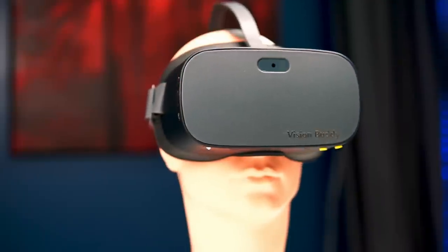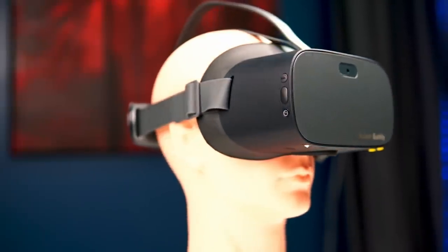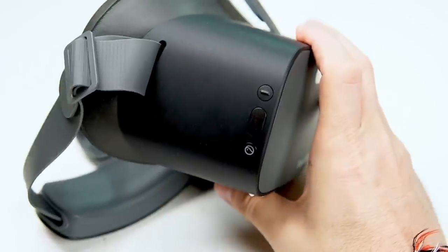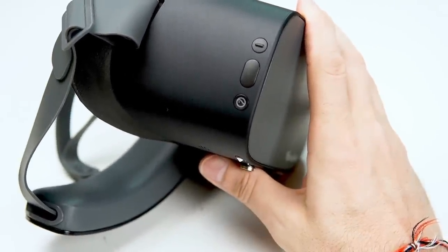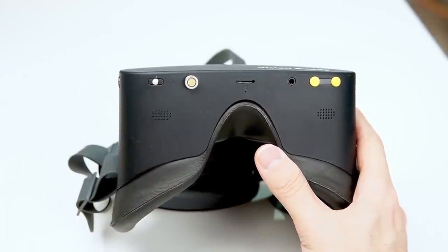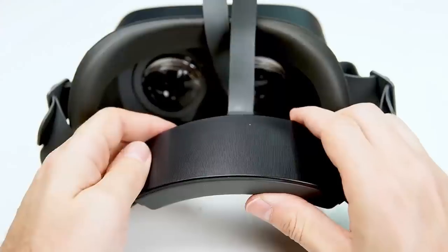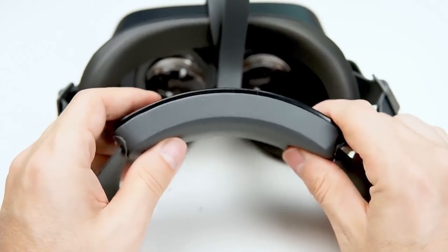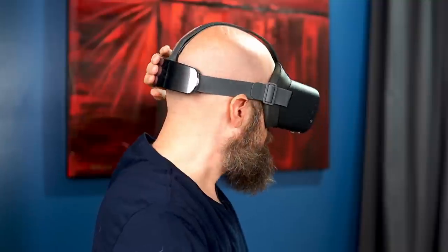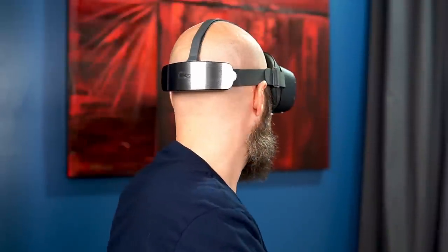The headset itself is a traditional VR-style headset — dark gray, one solid unit, not like other devices where you have to install a phone. You have buttons along the right side and bottom, as well as a charging port. The straps are adjustable to fit all different head sizes. On the very back there's a counterweight to help balance the headset on your head, so it doesn't feel overly heavy in the front.